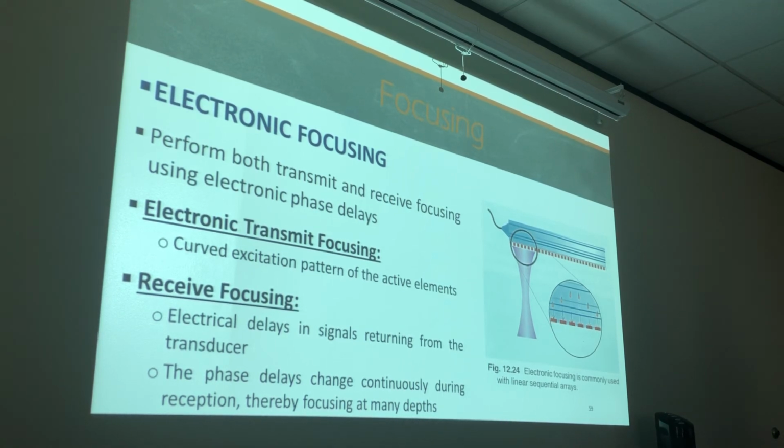Guys, if you need to study that, the end of that section again, where it's talking about linear phased array, at the end of the linear phased array section, it's telling you how electronic focusing and electronic steering is accomplished. Okay? It's all about how the elements are being excited, how the elements are receiving their electrical signals. Okay? Same chapter.